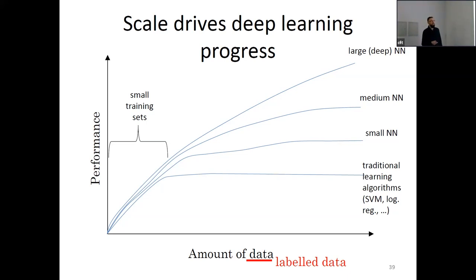The performance is incredible, but it's not only data, it's labeled data. So we need very big labeled data sets with very specific labeling. In the case of images, when we are talking about classification, it's easier than with segmentation, especially in the histopathology field.